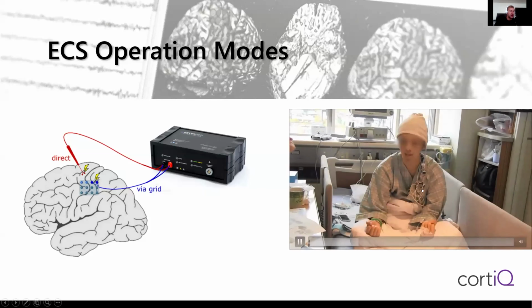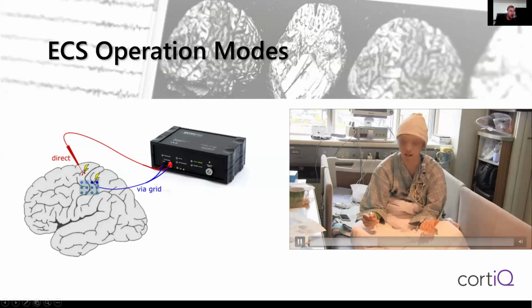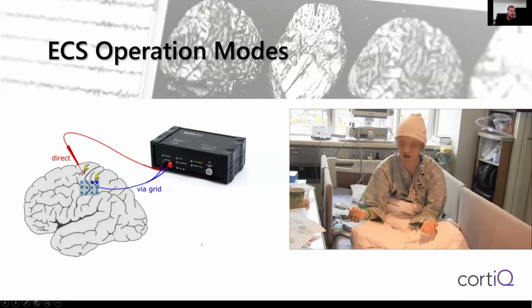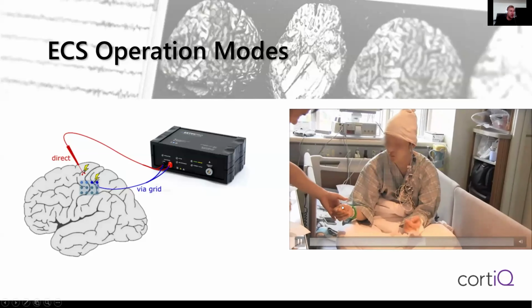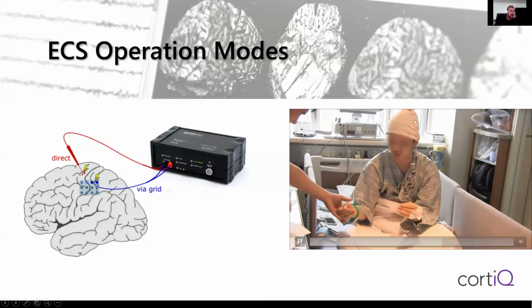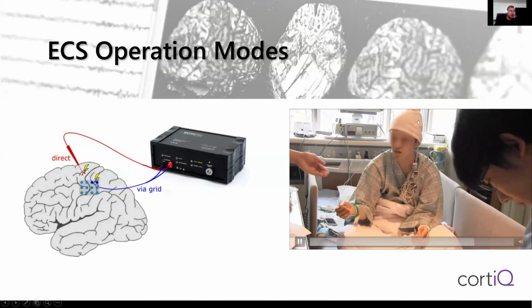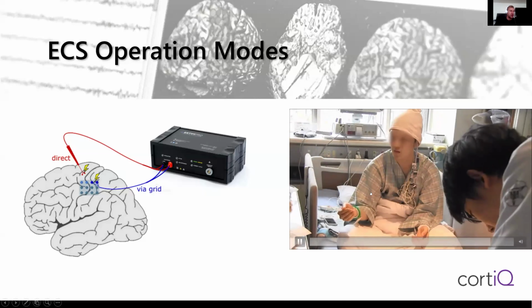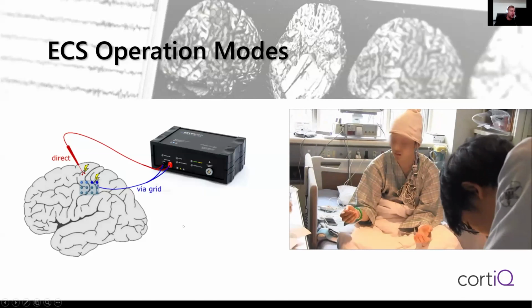So here, for example, in this case, the patient is now performing a baseline movement, and while the stimulation occurred, here again, the arm is lifting, so we can see that there is a definite change of the movement caused by the stimulation. So here the left hemisphere motor cortex is stimulated, and that was obviously an area that is related to the arm muscle.